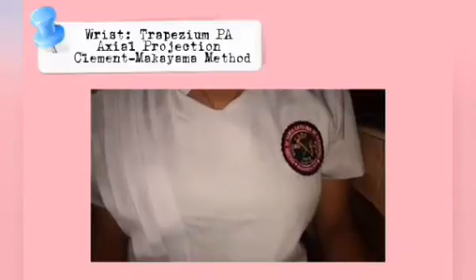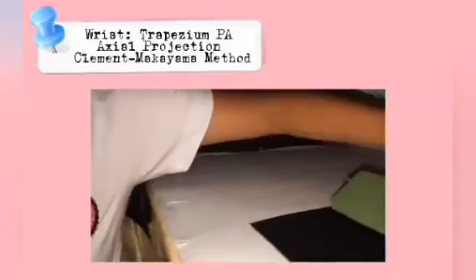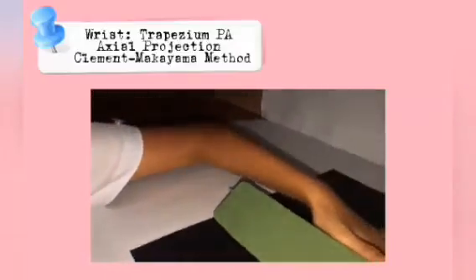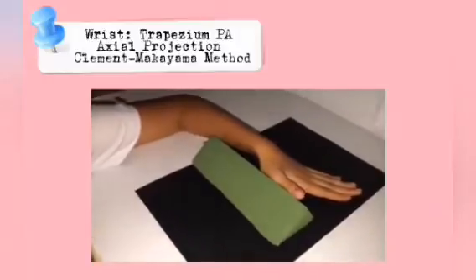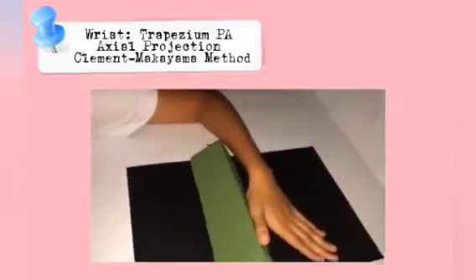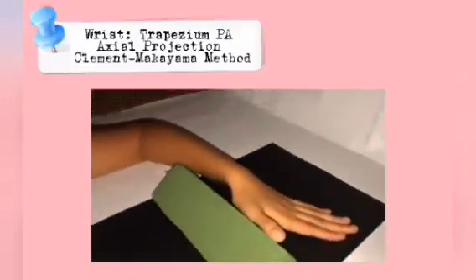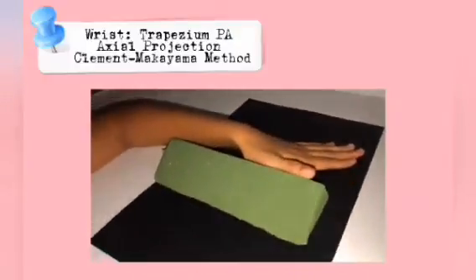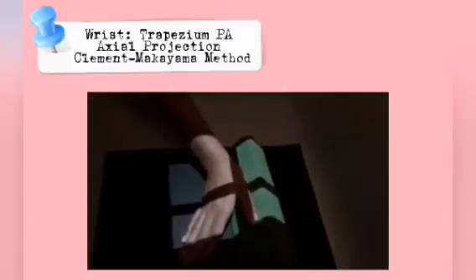Position of the patient. With the patient seated at the end of the radiographic table, place the hand on the IR in lateral position. Position of part. Place the wrist in lateral position resting on the ulnar surface over the center of the IR. Place a 45-degree sponge wedge against the anterior surface and rotate the hand to come in contact with the sponge.